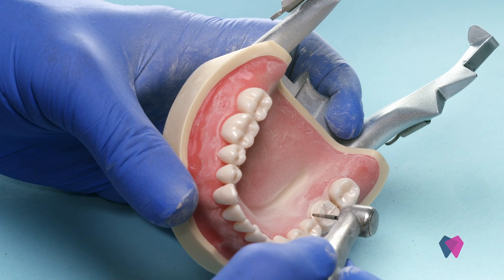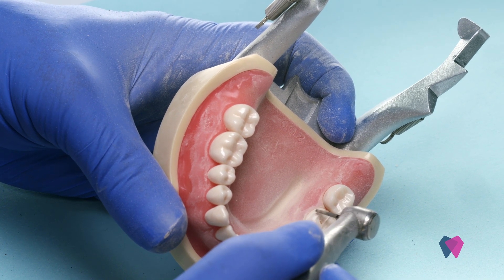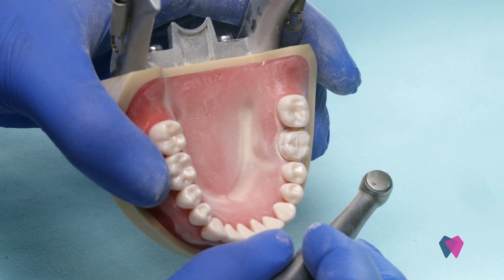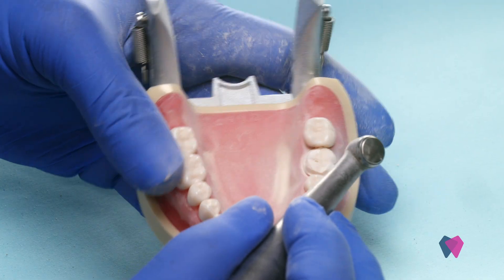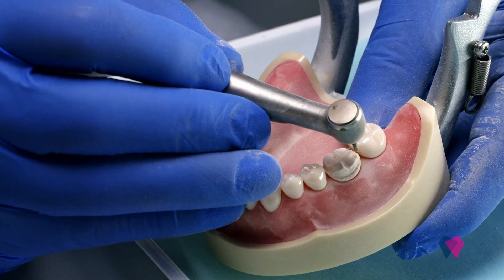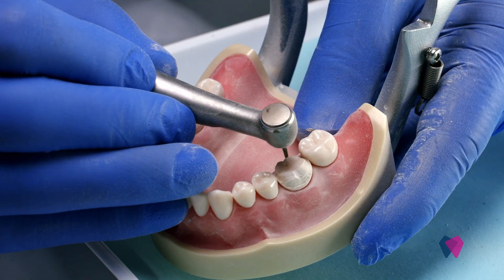We're going to do the same aspect on the lingual. And you've just about got your prep now. When you look down right on there, let's go ahead and try and smooth it up a bit — you see we've got a little sharp angle here. Let's make sure that when we look down on it that we've got nice draw, which we do, as I'm looking right down the center of it. I'm just going to try and smooth things up a little bit. It's a little difficult with plastic and a diamond, as you can see.